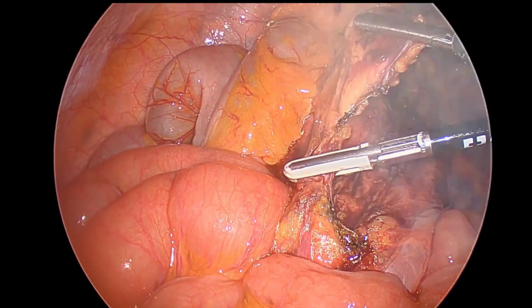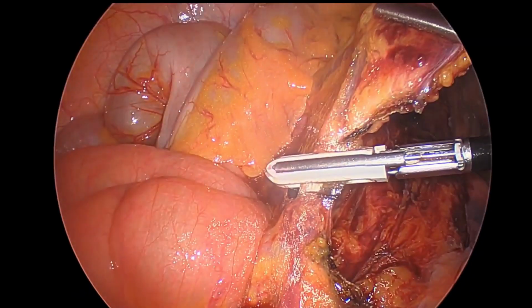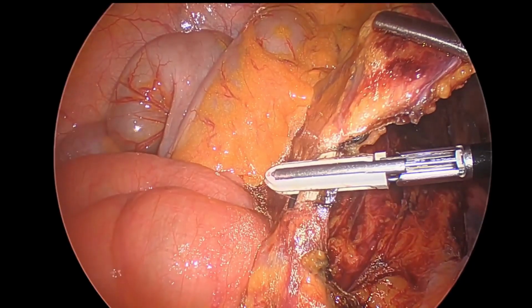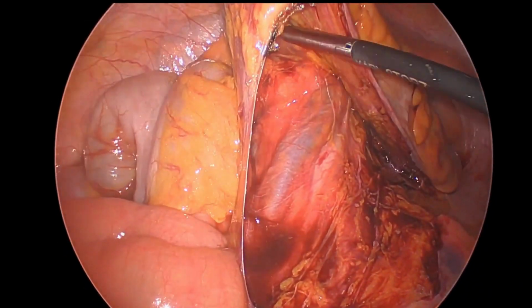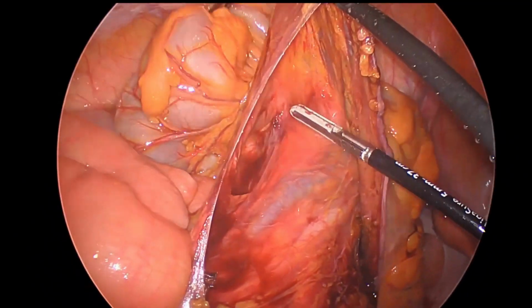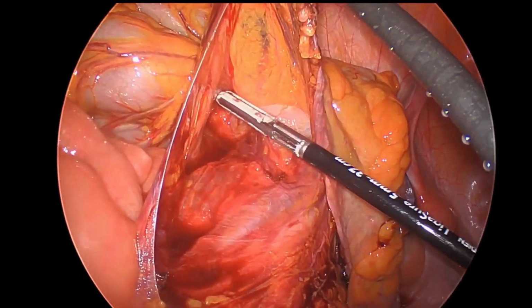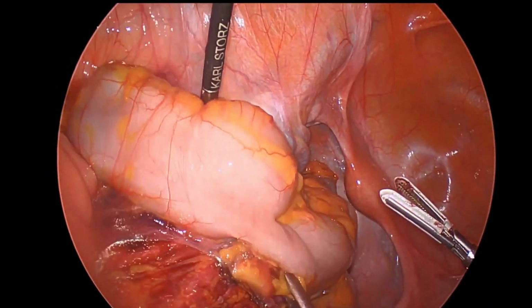So here we are taking the vessel with the ligature device. You can take it with clips, you can take it with the stapler. We tend to take it with an energy device. Here is the ligature. Again, we don't have any disclosures with respect to the company. It's just what we happen to use. You can use any vessel sealing device that you choose. And we're going to again try to exploit that retroperitoneal dissection, make sure that we have enough length.